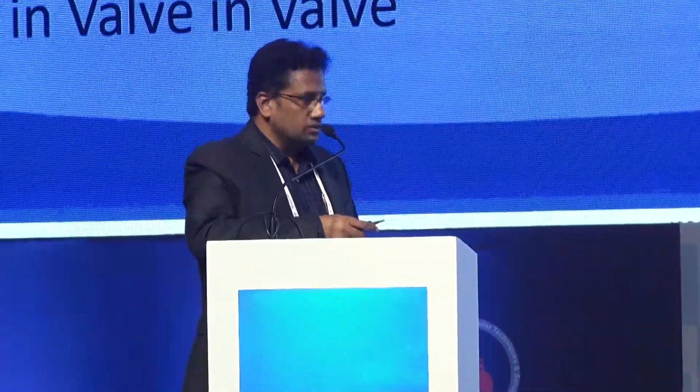In the 10 minutes, it will be difficult to touch upon all of these. So I'll probably touch on the most common difficulties we come across in the Indian setup. As earlier on when Dr. Praveen Chandra showed, 40 to 50% of the cases we deal with are bicuspid and significantly calcified. So that is a very challenging set.